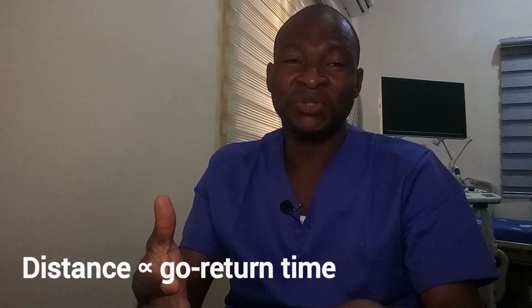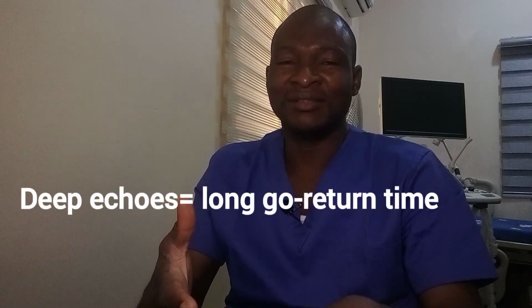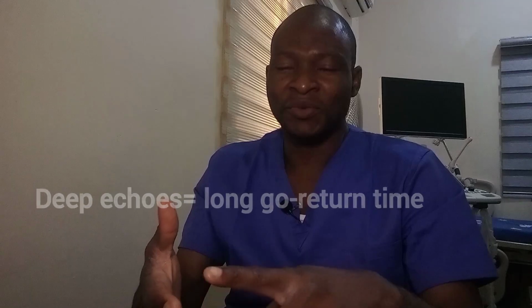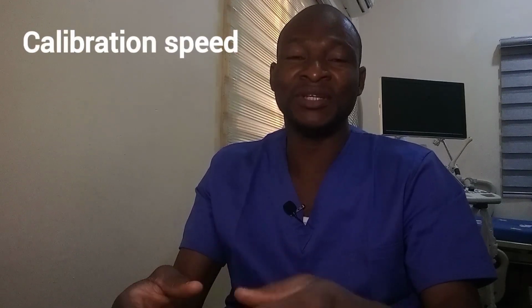So from the above equation, we can deduce the following. Distance is proportional to go-return time. Deep echoes have long go-return time. Superficial echoes have short go-return time. Now, in the range equation, the velocity of sound in tissue, which is 1.54, is programmed into the machine and it does not change. So it's actually the assumption on which the machine is built. It is called the calibration speed of the ultrasound equipment.